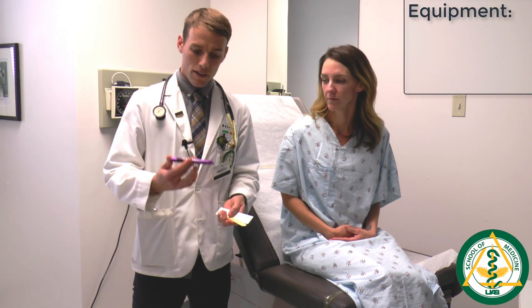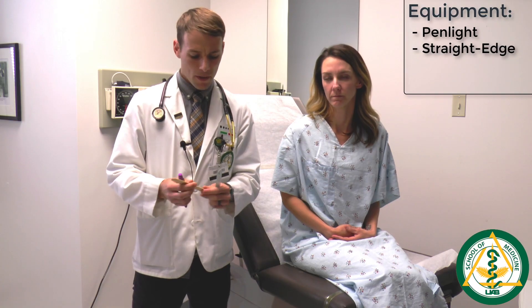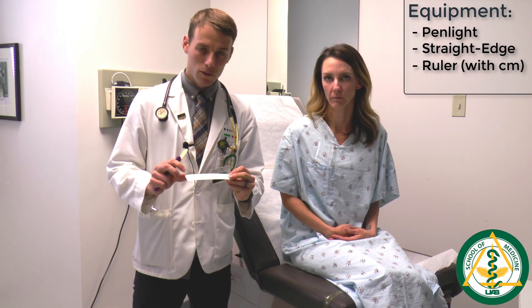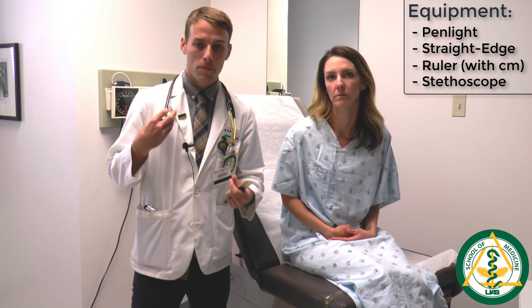Before you begin the exam, it's important to make sure you have what you need to complete it. I have with me a pen light, a straight edge which is just a tongue depressor that you can find in the rooms, a ruler with centimeters labeled on it, and a stethoscope with both the bell and the diaphragm available to assess heart sounds.